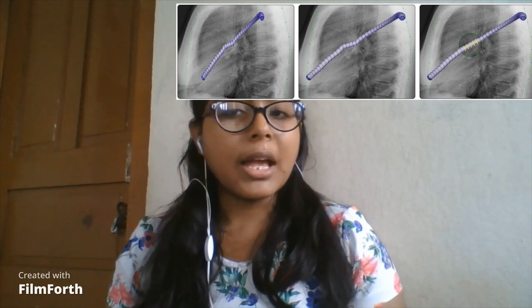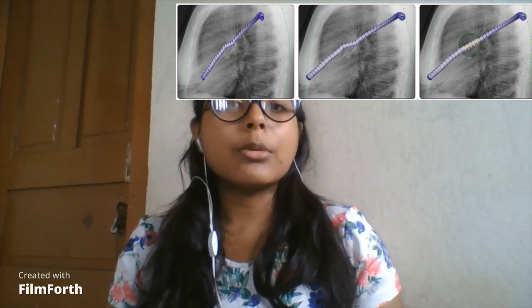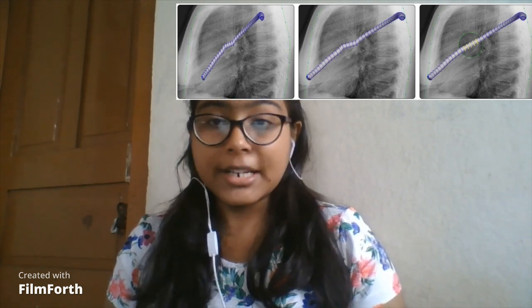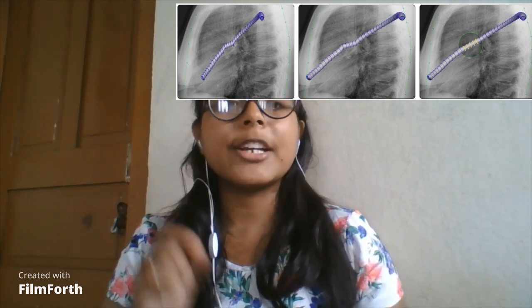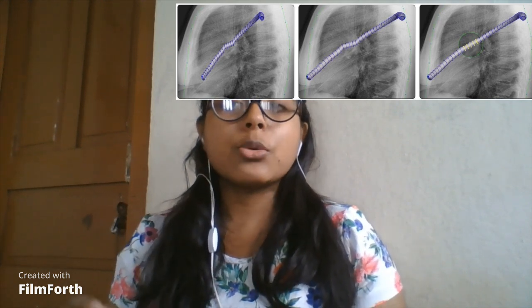A least squares regression line was fit onto each of the segmented edges and its angle was measured. The average angle of these least squares regression lines was found to be 24.8 degrees. For this reason, a rotation of 24.8 degrees is applied to each rib template.